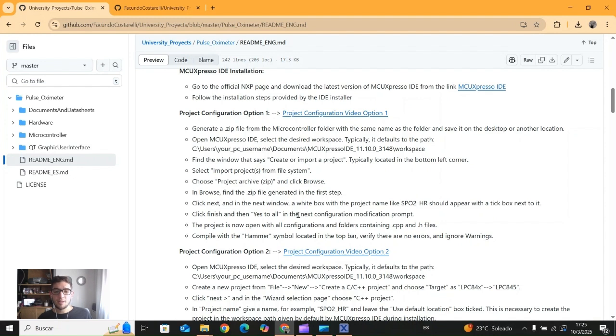Now we just click on next and we look for the next step. When we click next, the next window is going to be a white box, typically with the project name, in this case SPO2, heartbeat or heart rate. For this project, typically this name should appear with a tick box next to it, and probably other files, but the important one is this one. The next step is going to open all the configurations and folders containing .cpp and .h files.